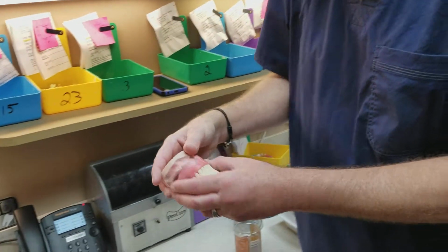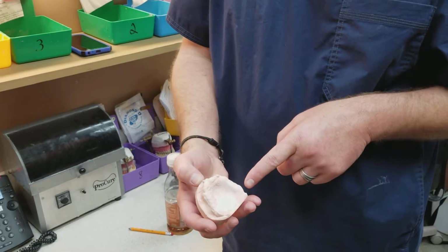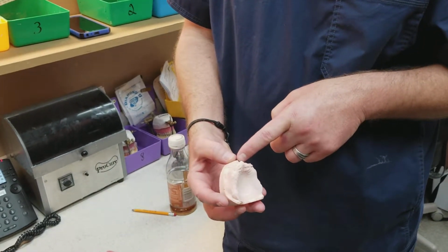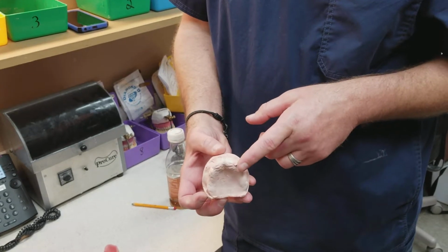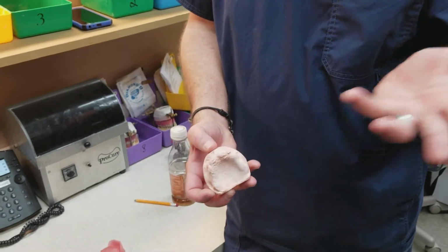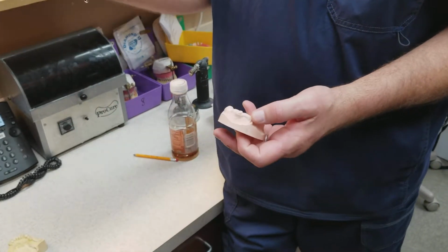And this is just like in removal, an edentulous area. I've got all the landmarks right there that I explained to you. That might be saved just because it's good for retention. And then, of course, I make my base plates and bite rims.